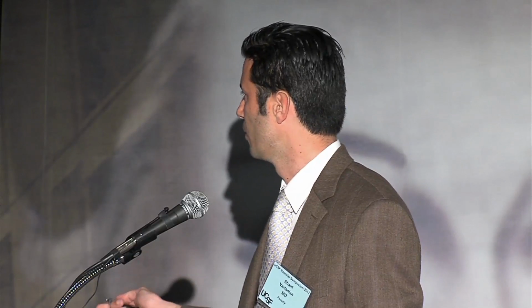What we're trying to do is find a subgroup of patients where you can really extend that advantage, and that was what really, I think, when I look at Dr. Saxon's data, that's what I really glean out of it, that you can't just routinely use this technology. You have to find the right patient where it may be beneficial. Hence, the focus on the patient with a particularly long lesion. Because, 70 to 80% reintervention, primary patency rate, they're not that different. They're more alike than they're dissimilar.